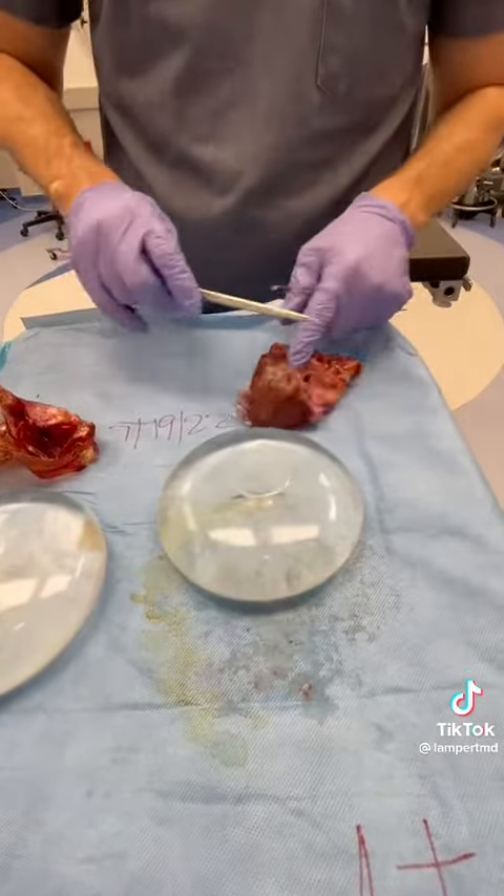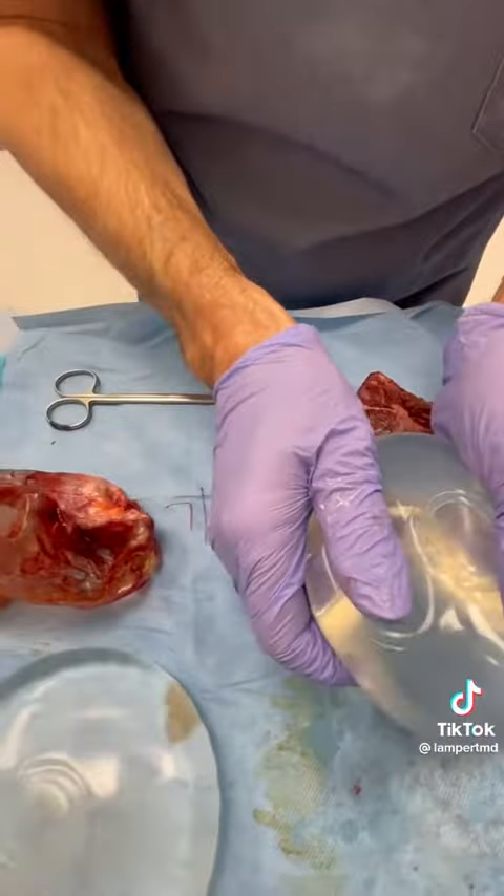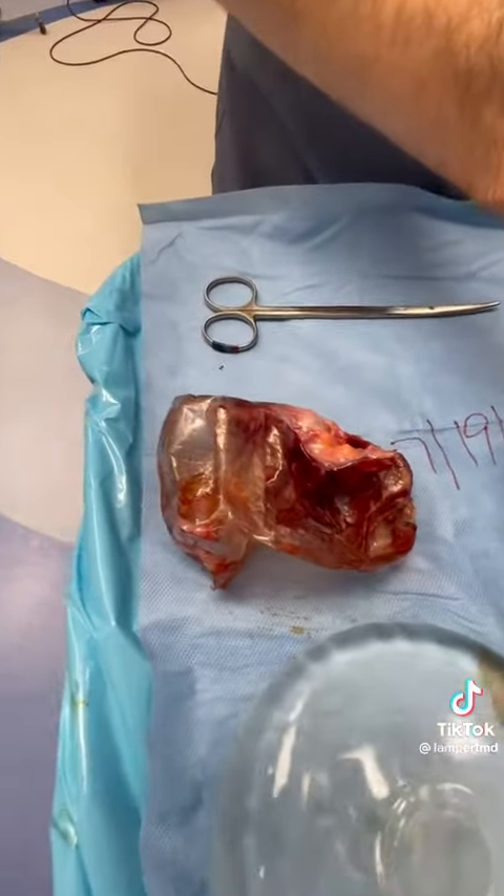All right. So we'll send this to Pathology — this all looks okay. And this one is also not ruptured, 450cc's Mentor.